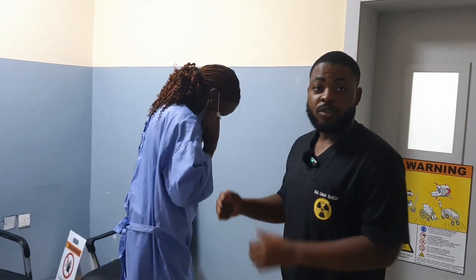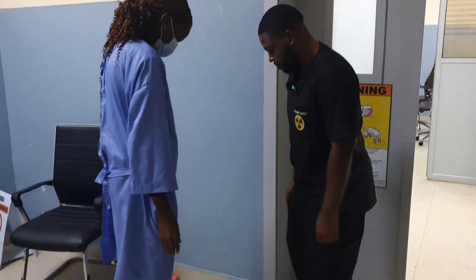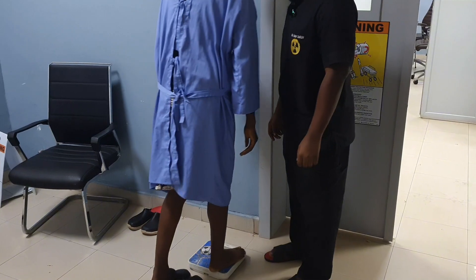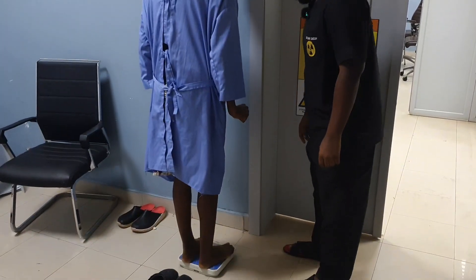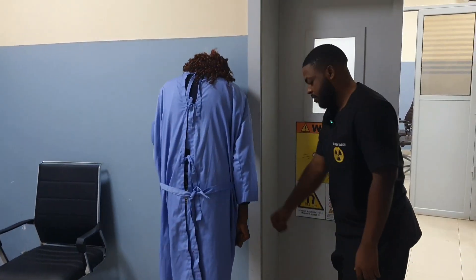So we're going to assess her weight first before we take her inside for the examination. So you climb here. Okay, that's 55. Okay, you can calm down.